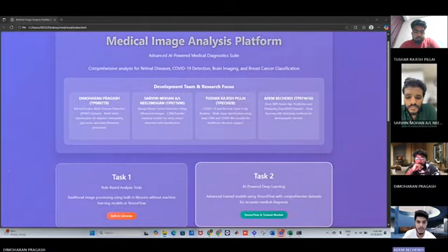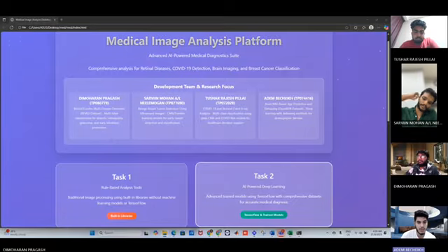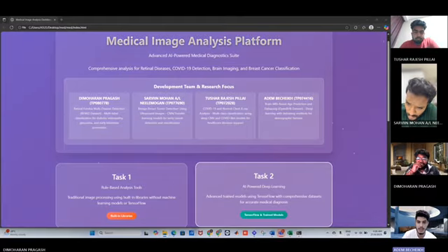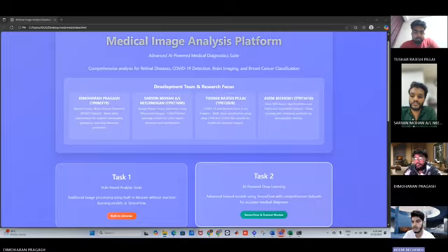Our system can process brain MRI scans, predict a patient's age, and generate a clear report. This project shows that medical AI needs extra care to handle scanner and site differences, which are not usually seen in normal computer vision tasks. Thank you.